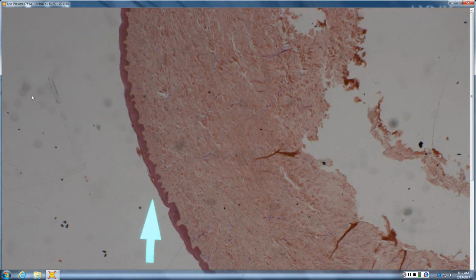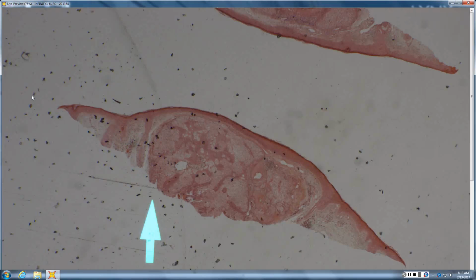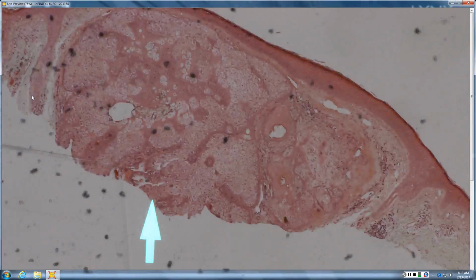So early nevus sebaceous, you're going to see tiny little hair germs all lined up vertically, right? Whereas this looks pretty atrophic and scar-like. Like an aplasia cutis, and then you always look underneath for meningocele, because aplasia cutis often has meningocele underneath it. Here we don't see anything underneath. Meningocele would look almost like angiosarcoma, vascular, like crack-like spaces sitting under a zone of aplasia cutis.